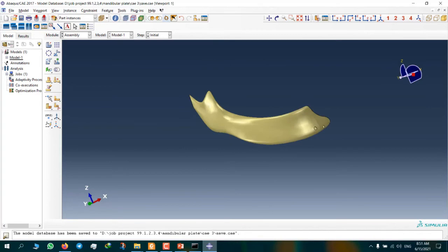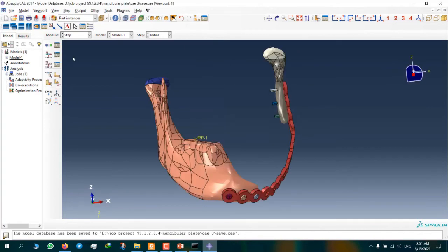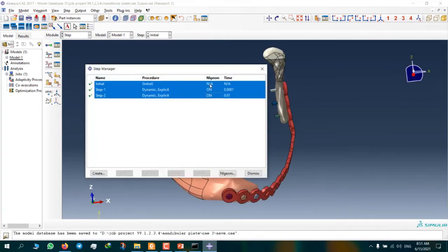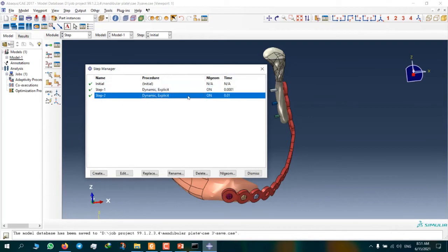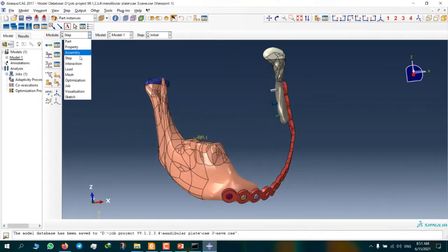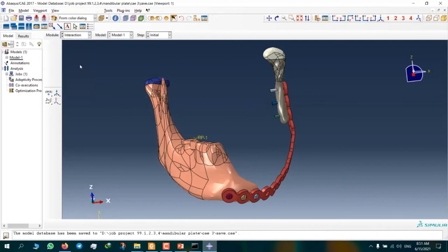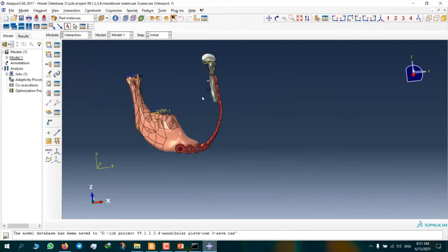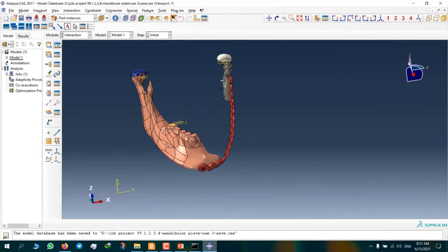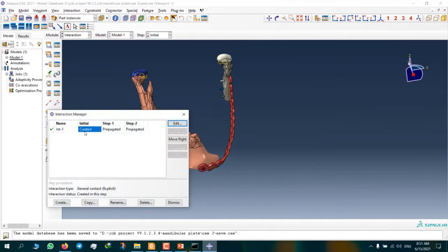And in step module, these are our steps. Step number two for loading. And here we have interaction, and here we can use general contact.